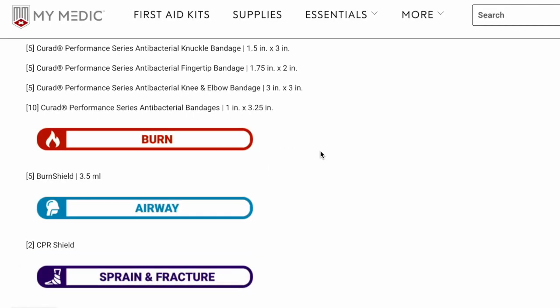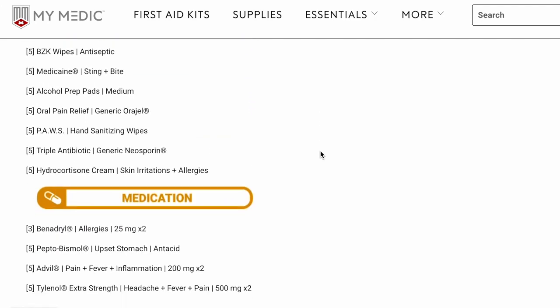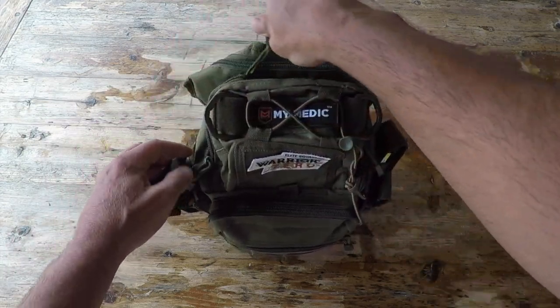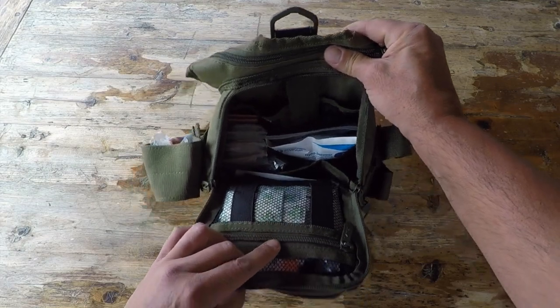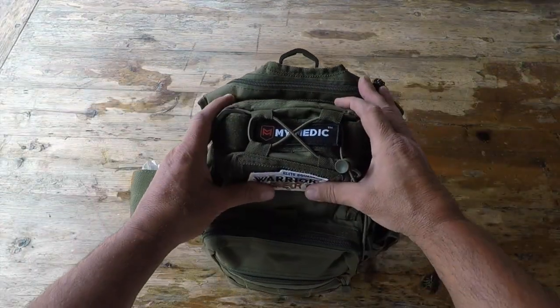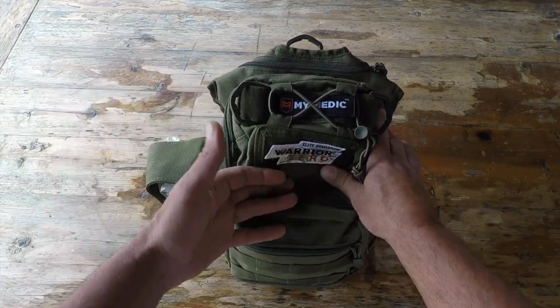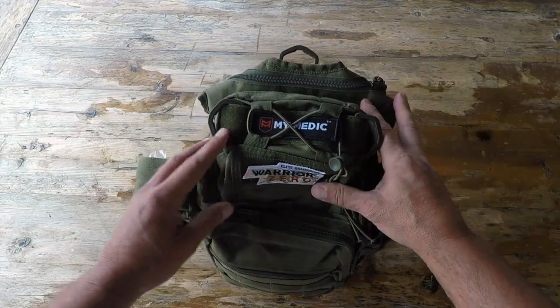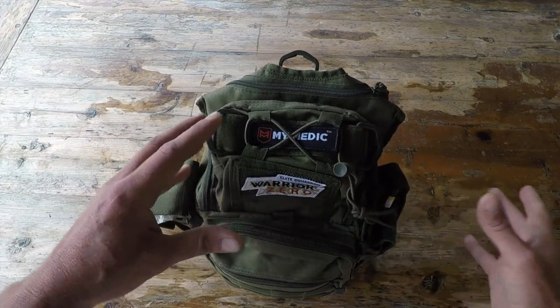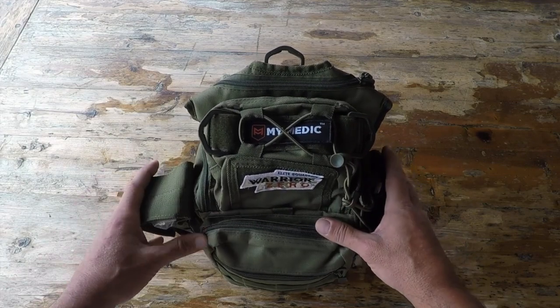Now I'm not going to list all the different contents that this kit contains, because that would add another 10 minutes to this review. I'll go ahead and list all of those components on my blog post, so make sure you check that out. This kit here is actually known as the Recon kit, and it's a medium-sized kit offered by My Medic. Obviously there are much bigger kits — there are boat kits, trauma kits, all sorts of kits depending on your needs — and also much smaller solo-type kits if that is something you are in the market for.